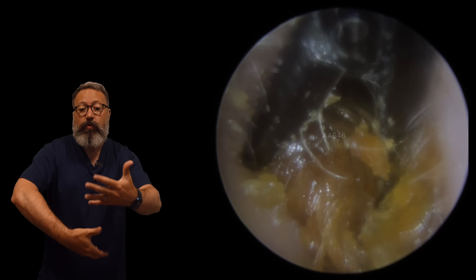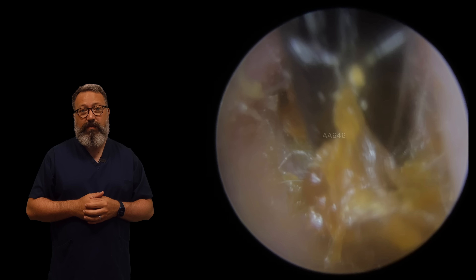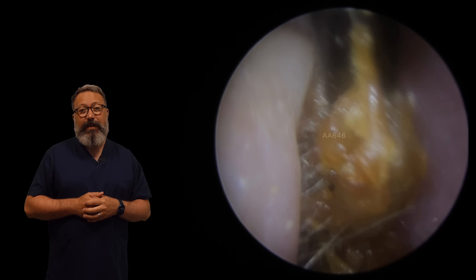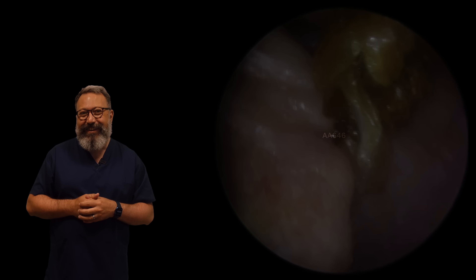We've got this little bit of skin on the outside there - just get the crocodile forceps on those as well. Now look at that piece of skin coming away there, it's coming away really, really well. That is huge.